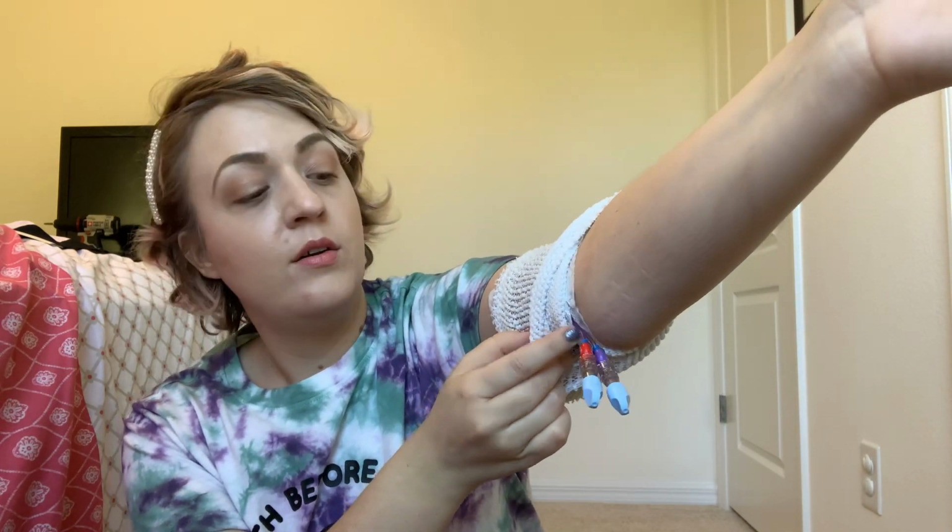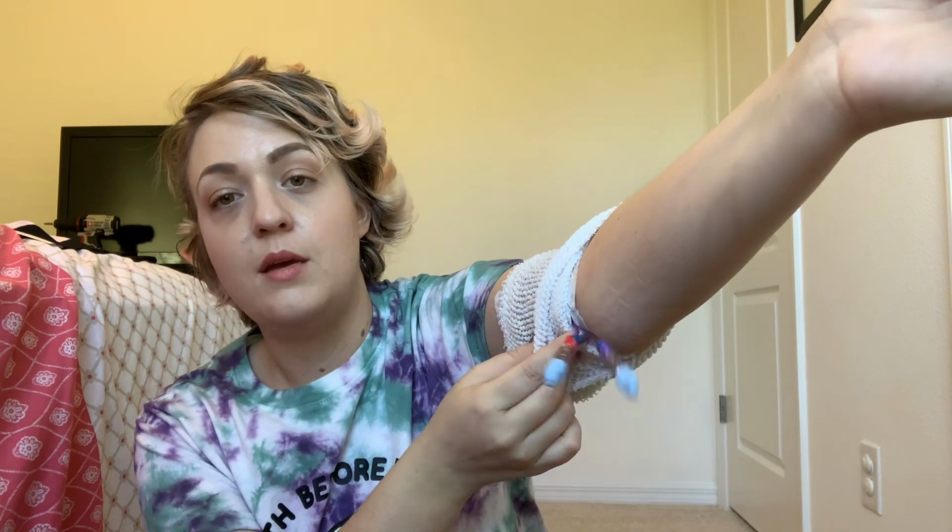It's the same thickness, but that's what's inside of your body. They actually measure exactly where it's gonna go. So they have measuring tape, and they actually drew like a tattoo. It's off now, but they draw it around your arm. They measure it up to your chest. They measure it over here. There's 2 people, and they verify each other, making sure that's measured right, because they don't want to put too long of one and then these hang all the way down your arm.